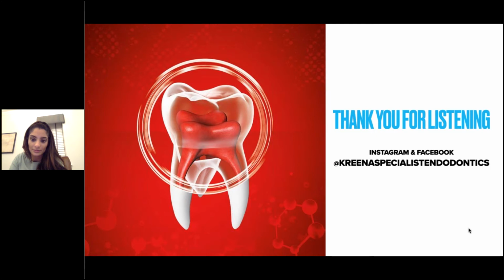How far do you go into the pulp for a partial pulpotomy? Normally a couple of millimeters, maybe about 2 to 3 millimeters of the coronal pulp tissue away. You're going to be doing this with a fast handpiece and a sterile burr, and then try and get hemostasis.